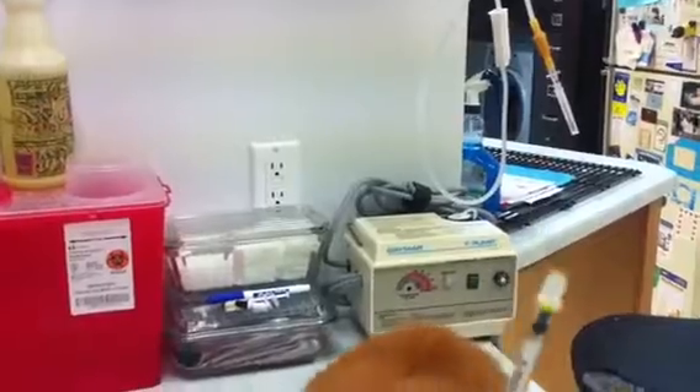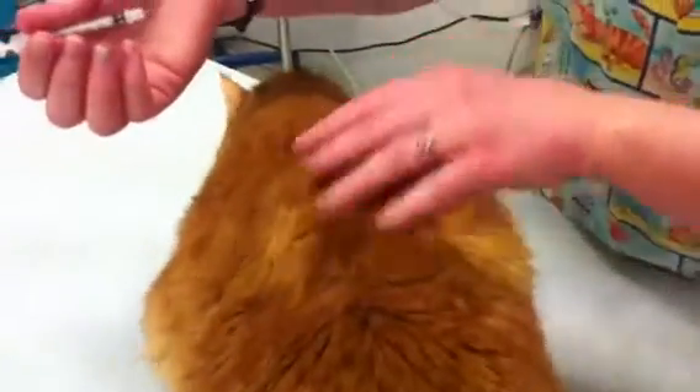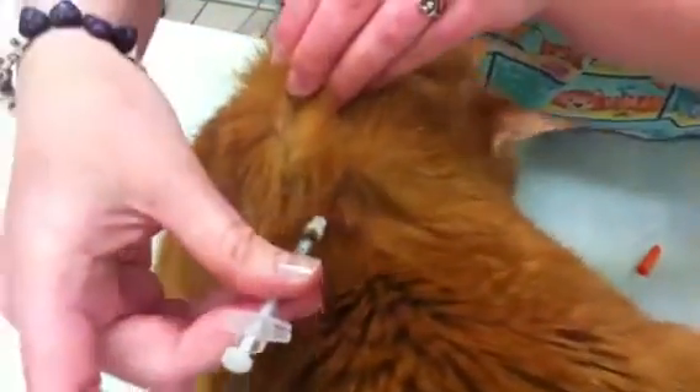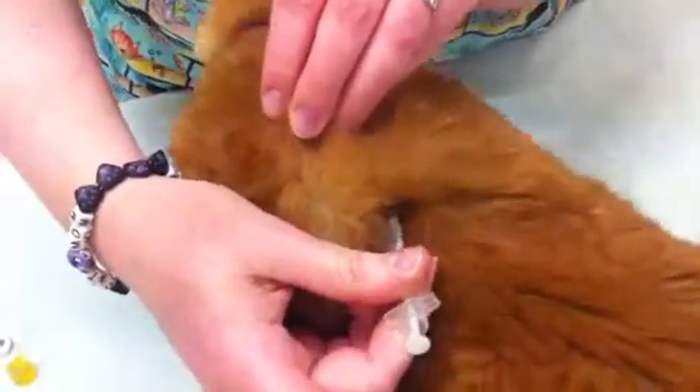Now you're ready to give insulin to your kitty. Treats are a good motivator to help kitty sit still. Insulin can be given anywhere there's extra skin — the easiest spot is over the shoulder blades. You pull up on the skin, feel for a little indentation, go ahead and slide your needle in. Once you're all the way in, push the plunger back and you're finished. Good boy.